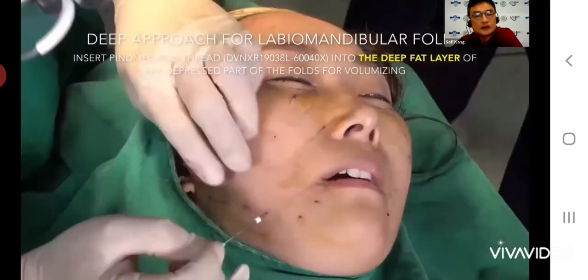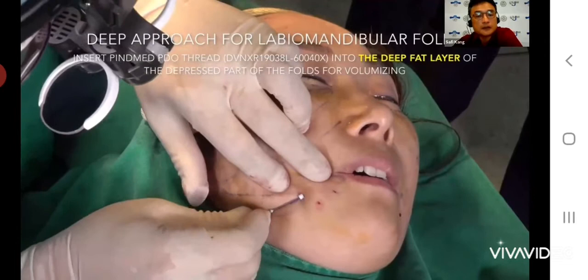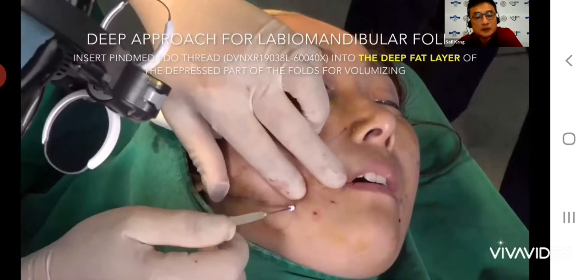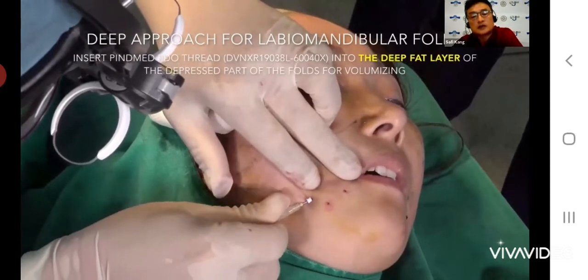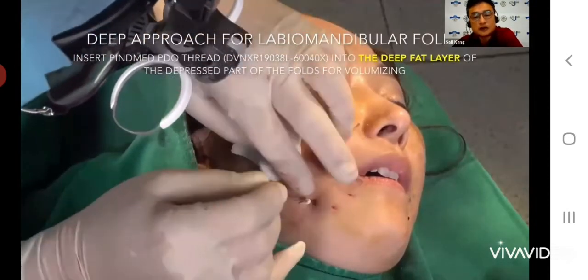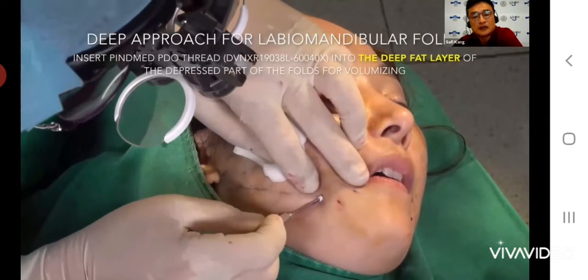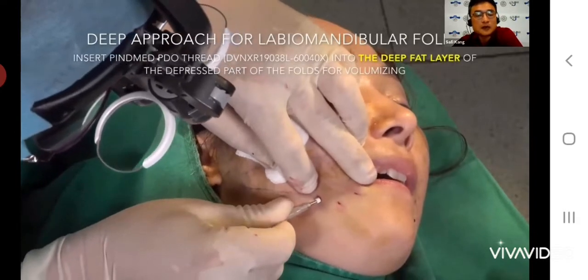But PIMBM or the other company developed the cylindrical mesh type thread. So when you insert the cylindrical mesh type thread into the dead space, the surrounding soft tissue migrates inside this thread. So they grow inside and make a volume.